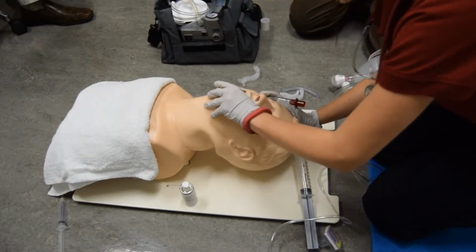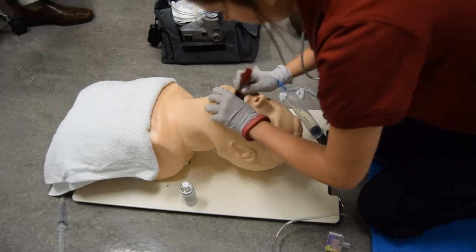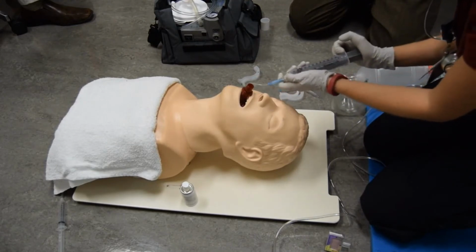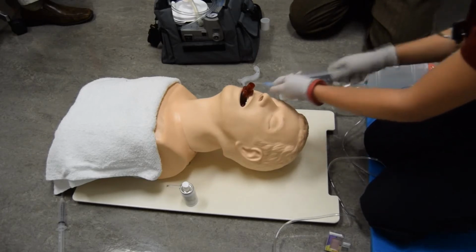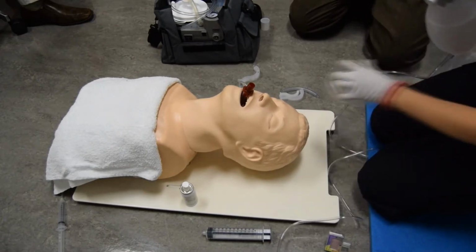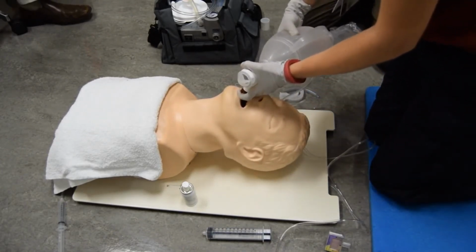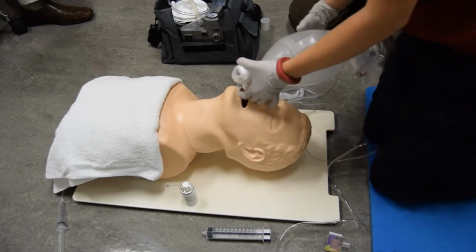Performs a tongue-jaw lift. Inserts device to proper depth. Secures device in patient, inflates cuff with proper volumes, and immediately removes syringe or secures strap. Ventilates patient and confirms proper ventilation. Correct lumen and proper insertion depth by auscultation bilaterally over lungs and over epigastrum. I'm pulling out as I ventilate until I see chest rise and fall.